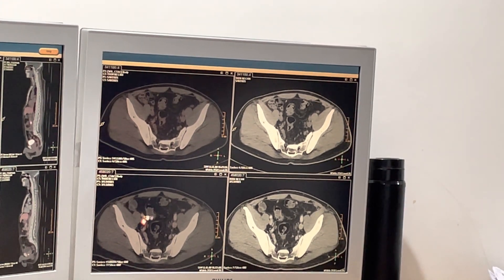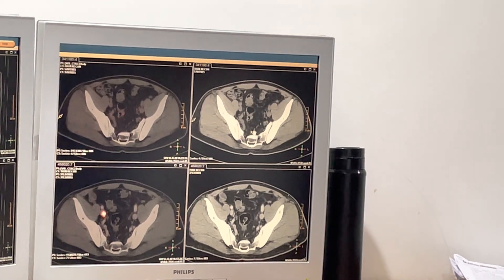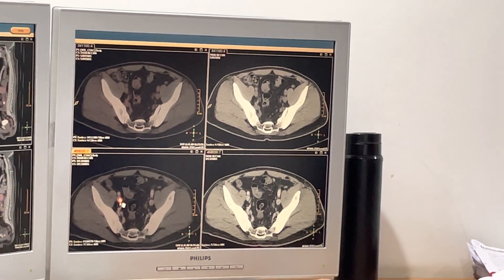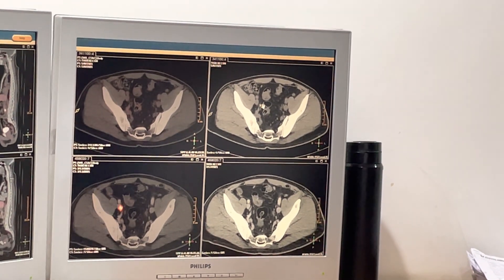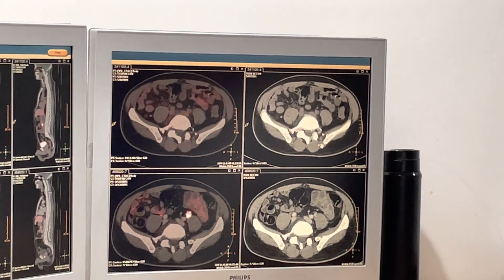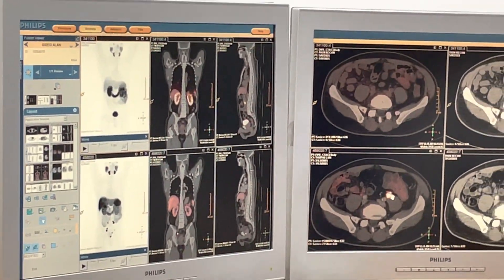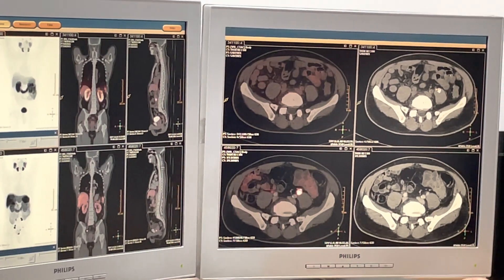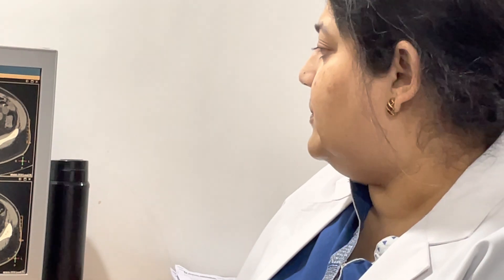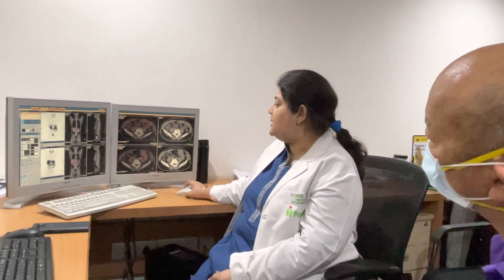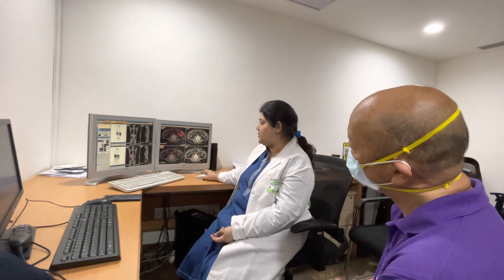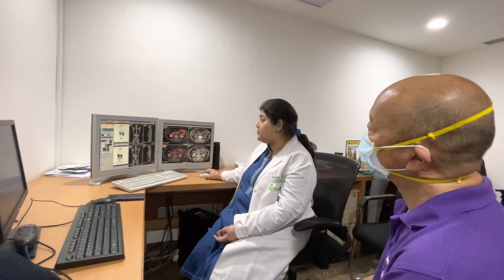Again another node here — you can see this was the node, and that node is not to be seen anymore. The lymph nodes are typically next to the vessels, so this was the node out here — this long thing — and you can see it's all gone. The rest of you is absolutely fine. This was another node which has disappeared. So this is both morphologically as well as metabolically a complete response — we call this an anatomo-metabolic remission. Whether you assess by size criteria on CT/MR or by metabolic criteria on the nuclear medicine scan, it's all gone. A phenomenal response to just one dose.